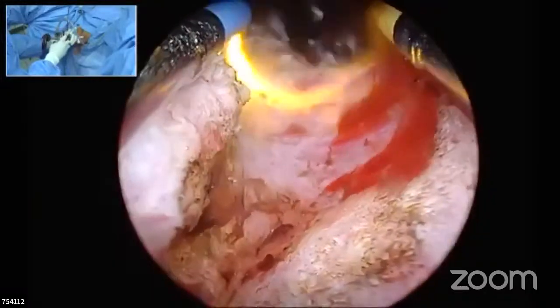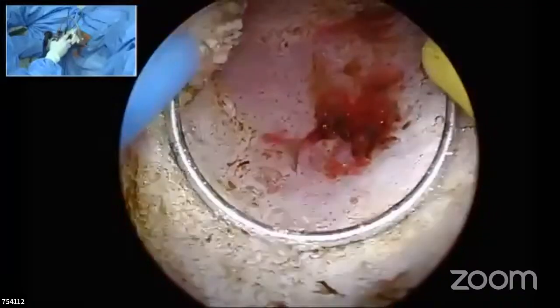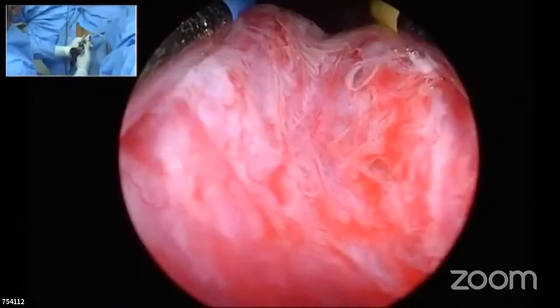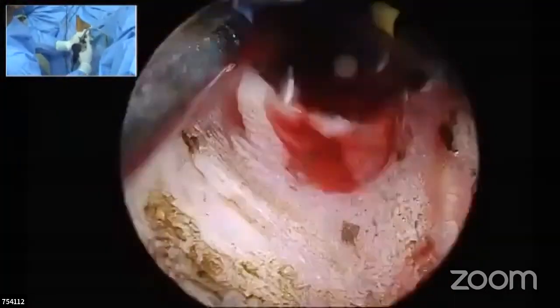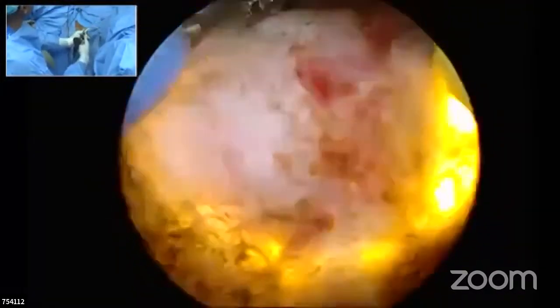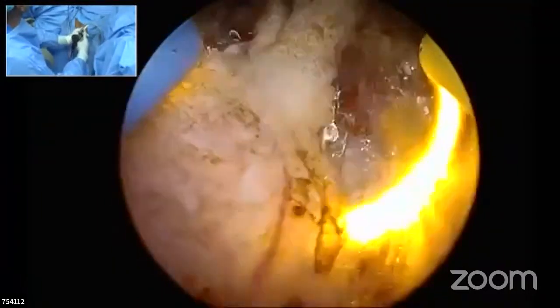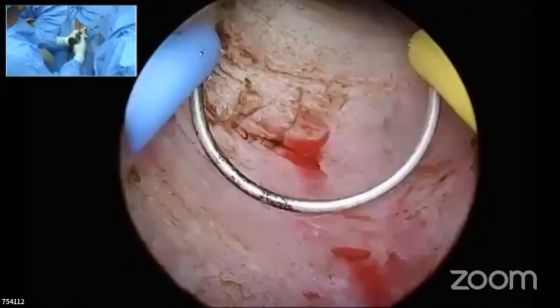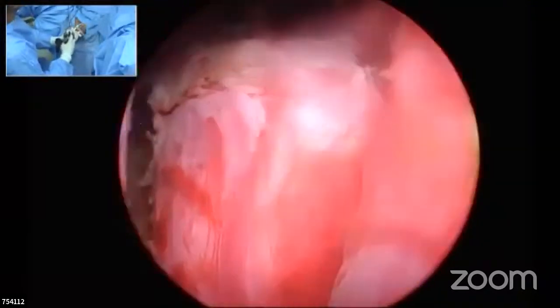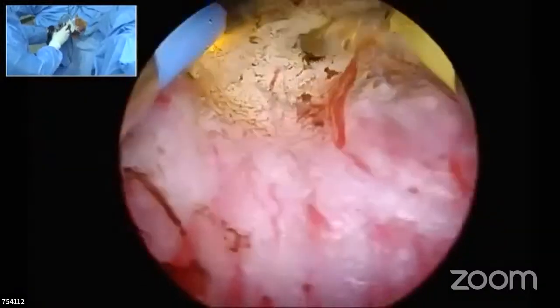So that's the bladder neck fibers, which you are already seeing. So control the bleeder directly here. That's control of the bleeder, and then start resecting the median lobe, which becomes avascular. So that's the actual way to be done whenever there is a large median lobe. So how much do you need to cut? You go on cutting till you see raw bladder neck fibers. Those are raw bladder neck fibers, and be careful that you're not going extensively onto the trigone. So these are the vessels which supply the median lobe, and controlling them makes the median lobe a little less vascular. So there are two ways of resecting the median lobe, what I have been talking about.